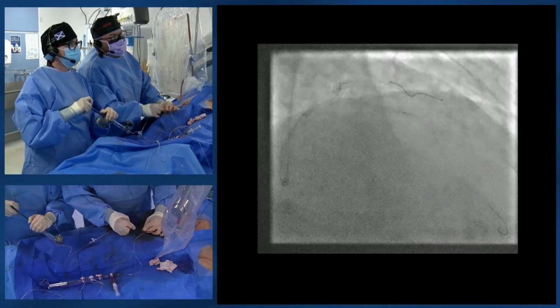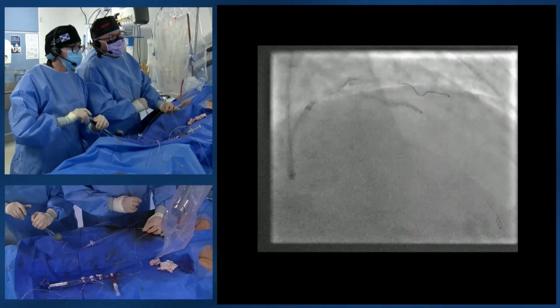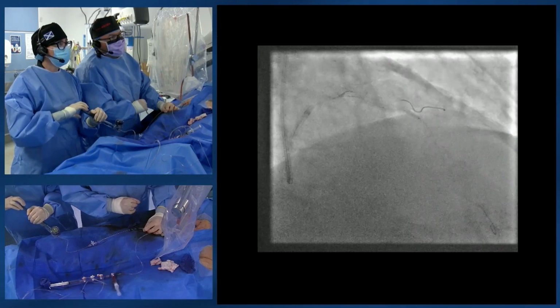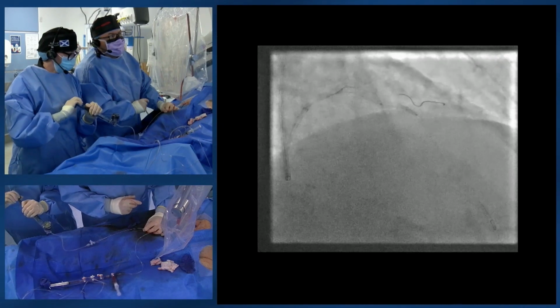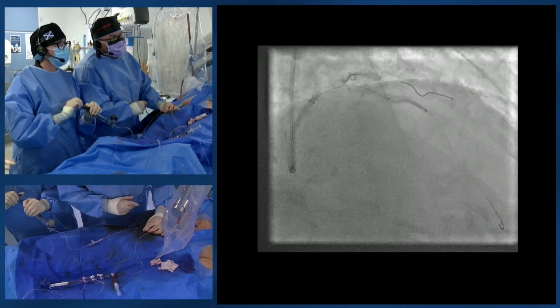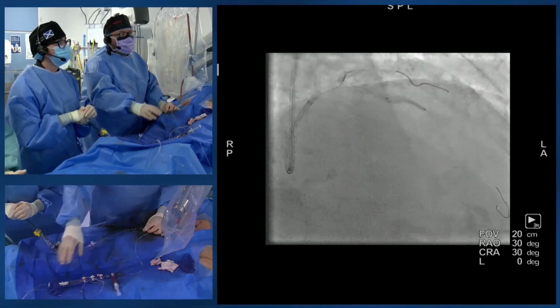So what do you think next, Margaret, for this segment? Yeah, so it's whether we want to try and get another OCT run to assess the calcium, or we're pragmatic about it. So this is going to be the problem, this area here, isn't it? So look at this. I suspect OCT won't track there. I agree, especially around there. Look at that. Okay, yeah. So you can really clearly see the encasing calcium in that segment.